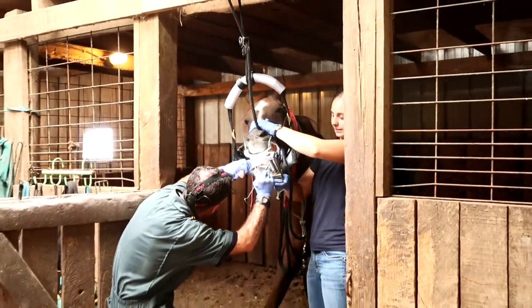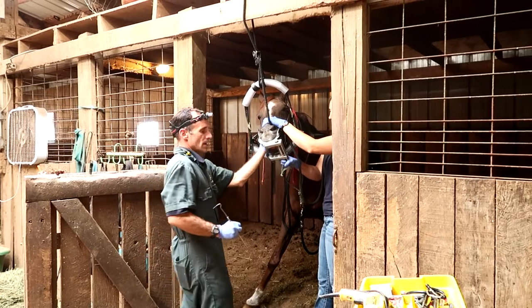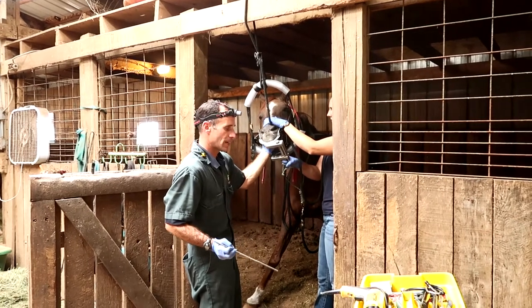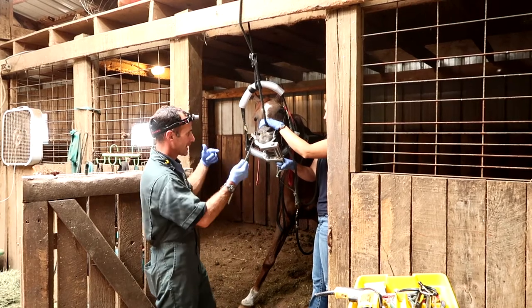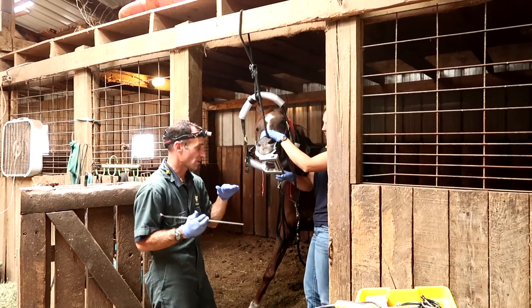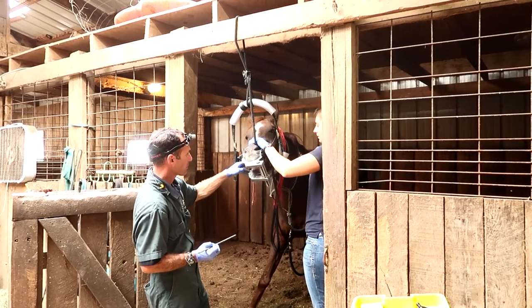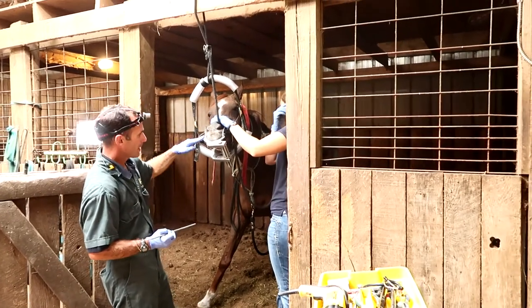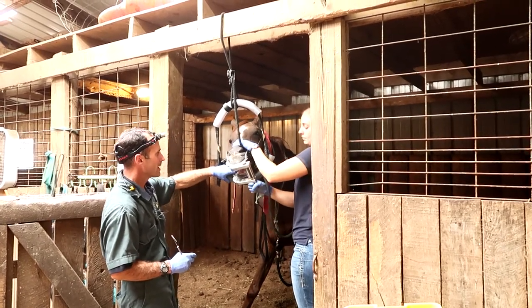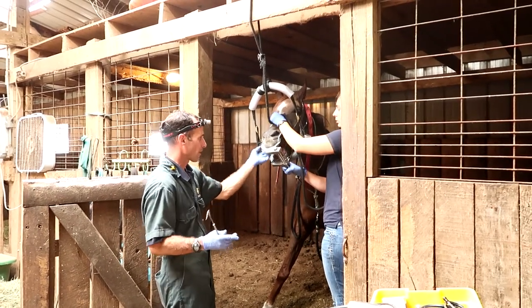He has some rough ones, and the good news is he doesn't have any real big buccal ulcers or anything of that nature. Our goal is to remove those outside edges of the upper and the inside edge of the lower. The leading first premolar — actually the second — is going to be addressed with what's called a bit seat. It's the very rostral leading edge of that first premolar on the upper and lower, where the bit lies in the bar of the mouth. When you pull back on your reins and the bit comes back, it should have a nice smooth transition into that dental arcade versus an abrupt point that will cause sensitivity.